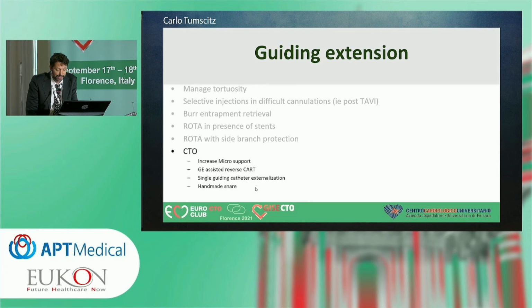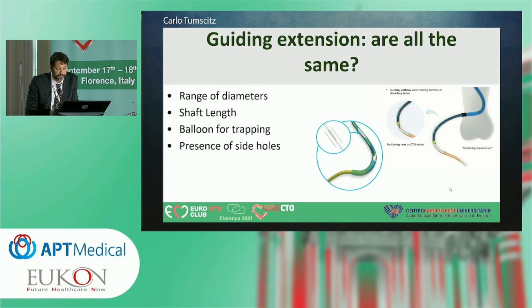Or we can create a handmade snare. I won't show you, but it's very clever. Sometimes it's useful when you don't have the size of the snare. You can use it to create a handmade snare.